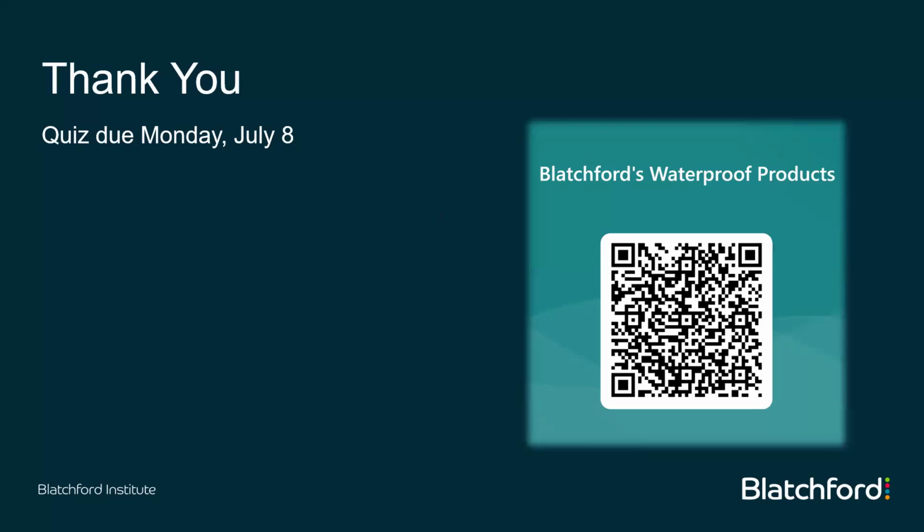But how do you order Aqualim? Somebody did ask there at the last second. And as a BMK2, so how do you order the Aqualim? You can just contact your Blatchford territory manager and they can get that on order for you. It does come in transtibial or transfemoral. Please note there is a difference in proximal adapters and it's got to be made into the socket. The way that the proximal adapter is fabricated needs to be accommodated in the socket. So just keep that in mind. But you can contact your Blatchford territory manager and they'll be happy to help.